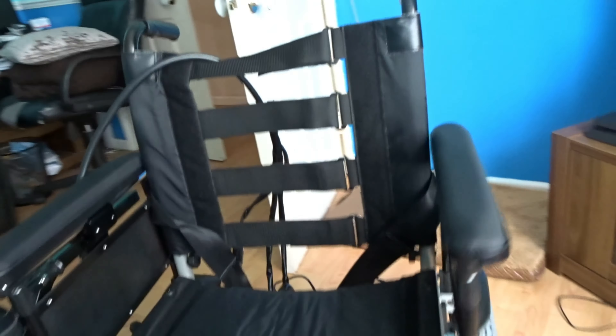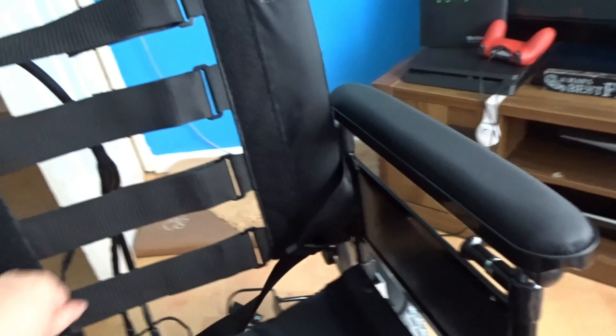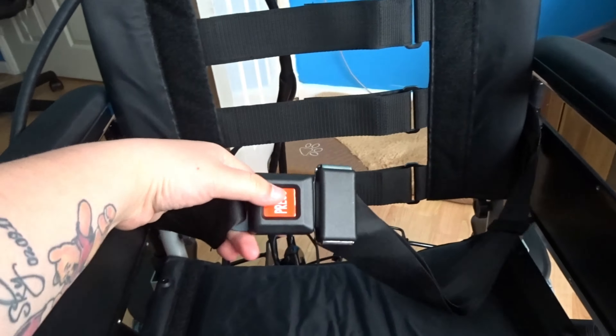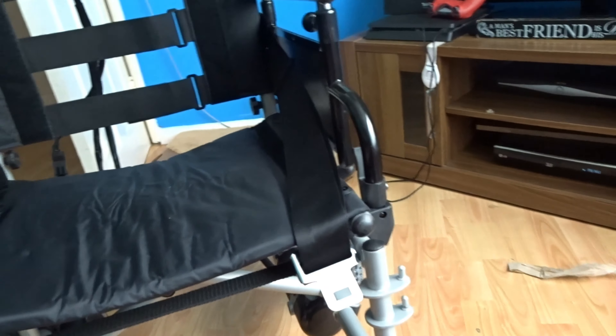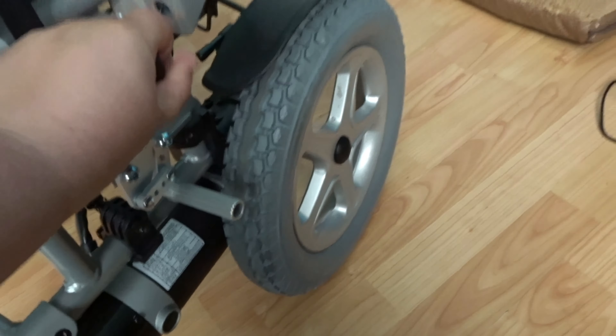So this is what it looks like at the moment. It's got a safety belt — my last normal one didn't. And honestly, if anything went over too fast, you'd be flying out. I almost did at one point. So these are the brakes. I'm going to take them off so it's much easier to move.